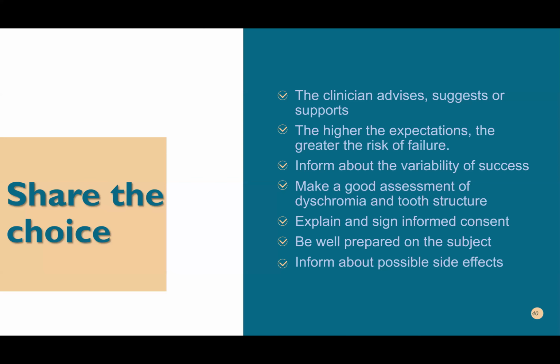Maybe I have some questions where people say, okay, I'm doing the click, but at the end I rinse with water to remove the product and I have some red stains. The problem with this kind of red stains is that we didn't remove the biofilm as we should. So there was biofilm present, so the product is going to attach itself to the biofilm.